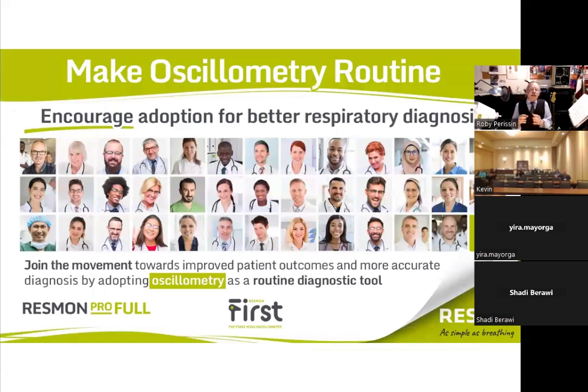So I'm going to start from the end and just tell you where we are now with oscillometry. Oscillometry can now be made a daily clinical routine. It has international guidelines, rules, and thresholds for significant response to bronchodilator, and a procedure that you can follow as quality control. It has all the different advantages that come with oscillometry. And in the US, where I used to live, it is reimbursed.